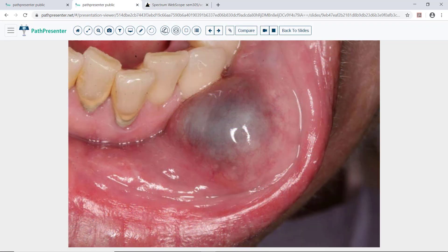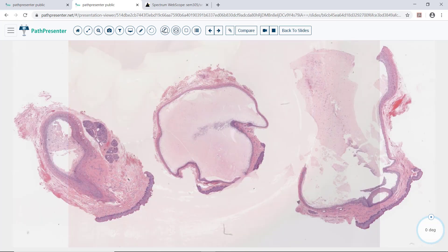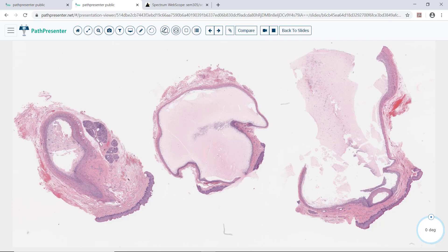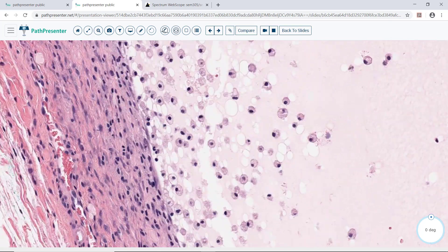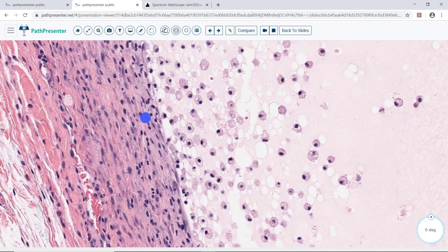Case three is the mucocele. You can see the mucocele right here — it is a smooth-surfaced, cystic mass. On histology, you can see there are three pieces of tissue. The centerpiece demonstrates a cystic mass filled with mucin. At higher power, you can see there are a few inflammatory cells in the lining, a lot of macrophages, and mucin on the right. This is the appearance of a mucocele.